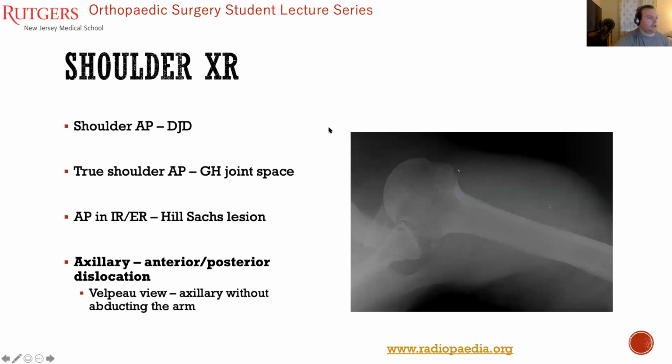Hill-Sachs occurs as a defect in the humeral head on the posterior aspect following a glenohumeral dislocation. The Hill-Sachs lesion itself is defined strictly as the posterior structure as related to an anterior dislocation. Again, you want to check to find the coracoid. Note that the humerus has gone out anteriorly, and as the soft tissue and muscles around the shoulder contract to try to prevent the humerus from moving further, the humeral head is impacted on the anterior aspect of the glenoid.